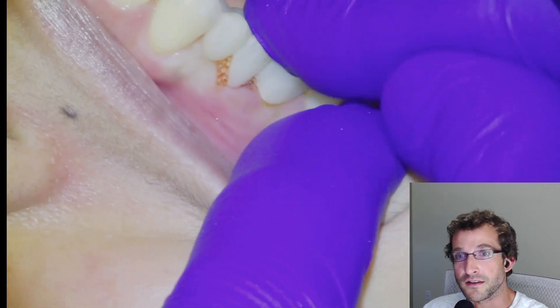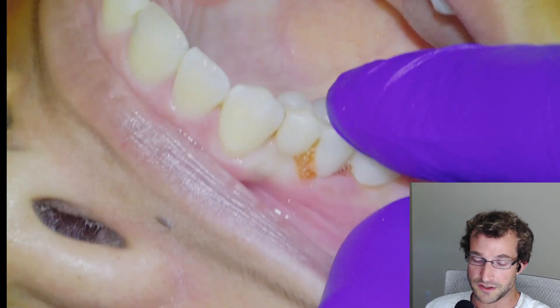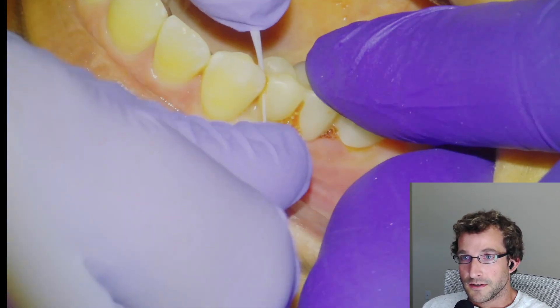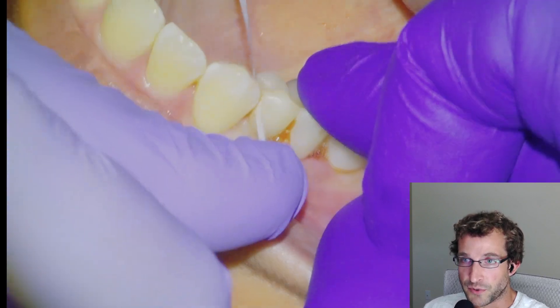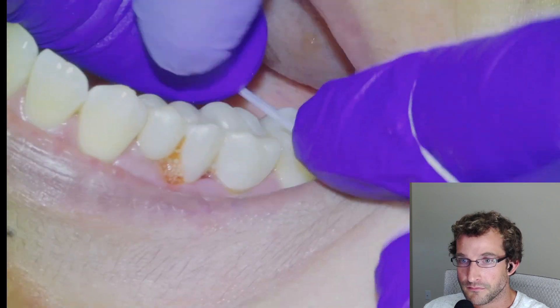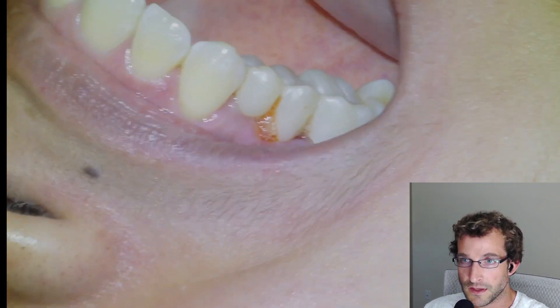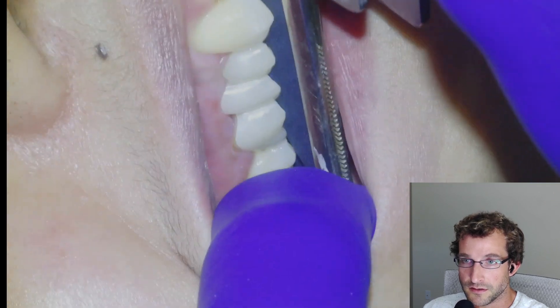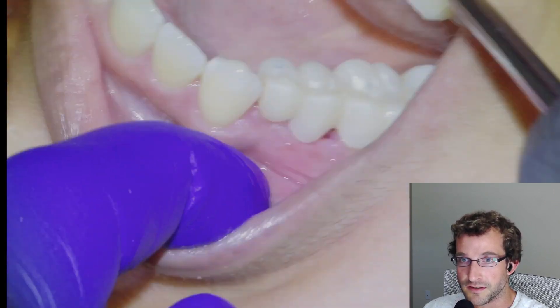I think this is probably A2 — would have made an A2 and an A3. We'll check the mesial contact of the cantilever pontic, make sure it's not too tight, and check the distal contact — you might see this one with a cotton roll. How does the bite feel when you bite down hard? We'll check the bite, make sure that there aren't any high spots.